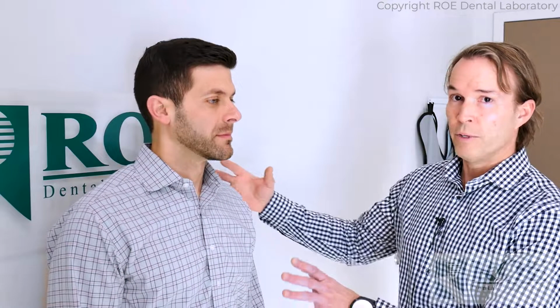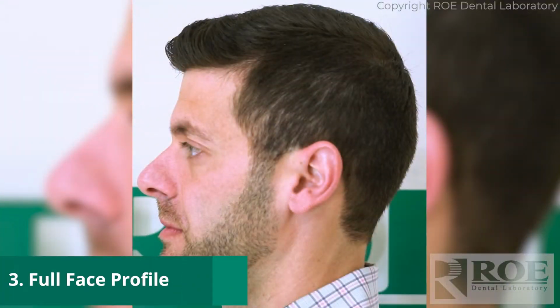And then the third picture, we will have the patient stand sideways profile and still keep the chin up. This one is not quite as critical as the rest because we're not going to do a smile simulation with this picture. Just take a couple of photographs at a profile, and those are the 3 photographs that we use. Now that you've learned to take the perfect Chrome photographs, let's talk about some pitfalls.